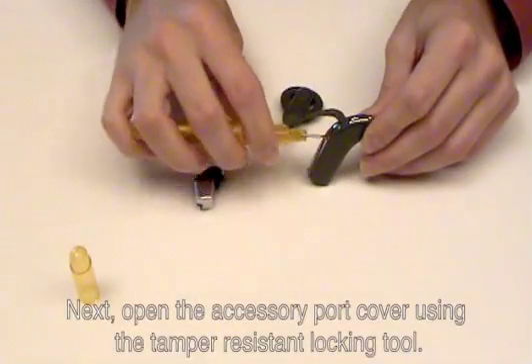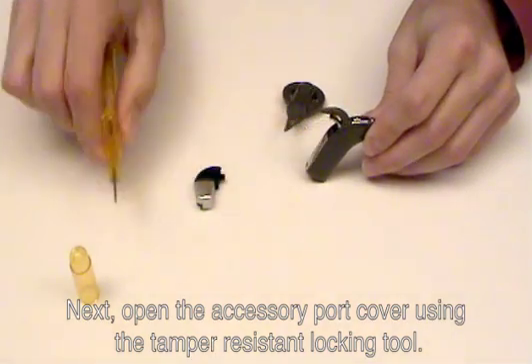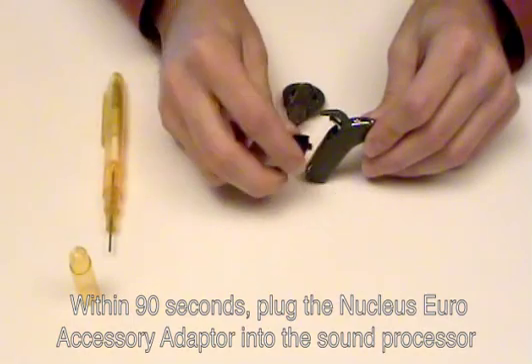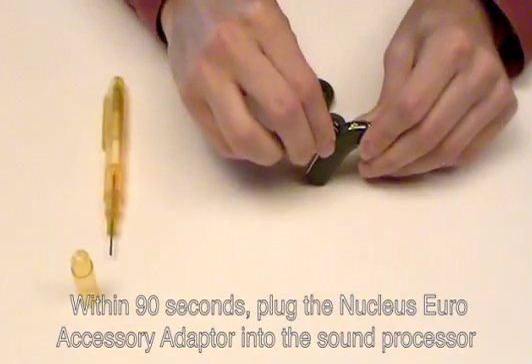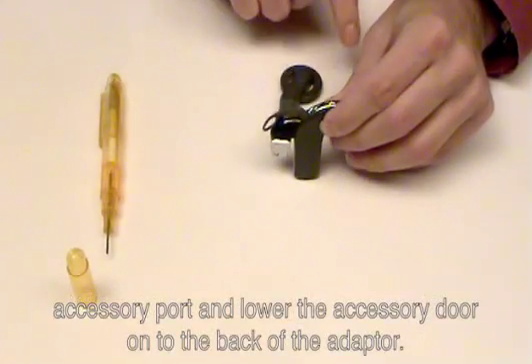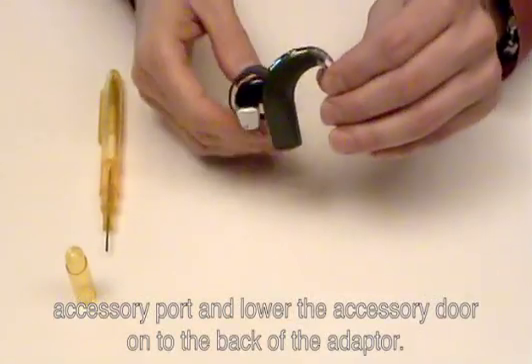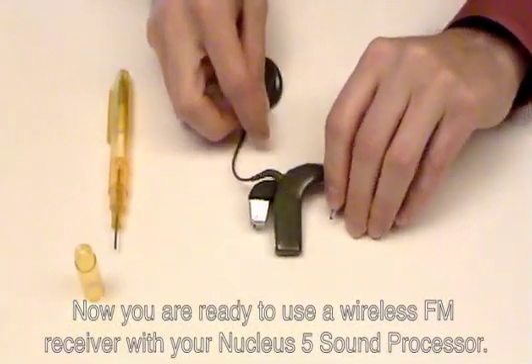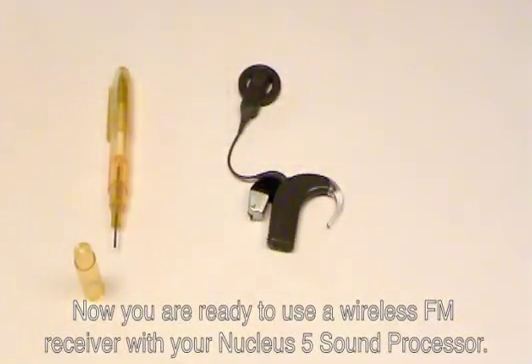Next, open the accessory port cover using the tamper-resistant locking tool. Within 90 seconds, plug the Nucleus Euro accessory adapter into the sound processor accessory port and lower the accessory door onto the back of the adapter. Now you are ready to use a wireless FM receiver with your Nucleus 5 sound processor.